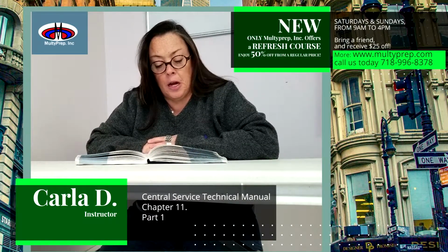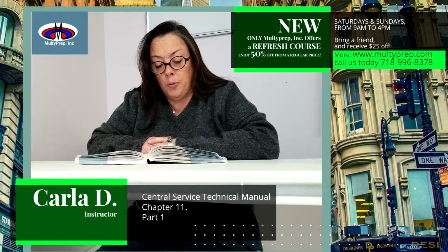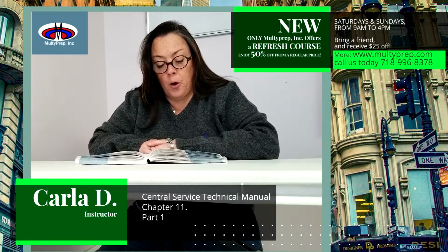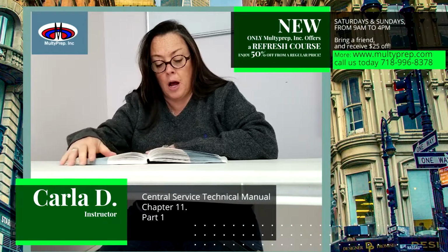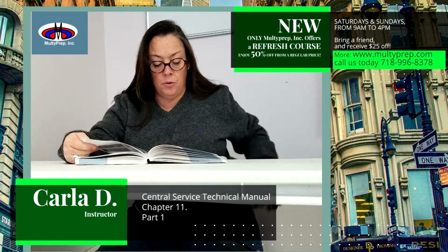One end of the hose attaches to the motorized handpiece on the surgical field, and the other end attaches to the source of compressed gas, which can come from a standalone cylinder or tank with a pressure regulator. See figures 11.8 and 11.9 for an example of pressurized tanks. These pressure regulators are piped in through a wall or a column-mounted regulator panel. See 11.10 as another example.